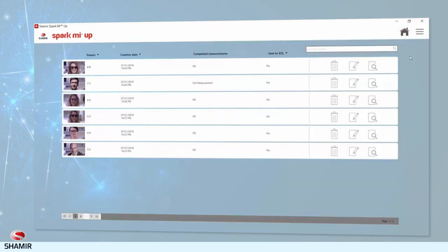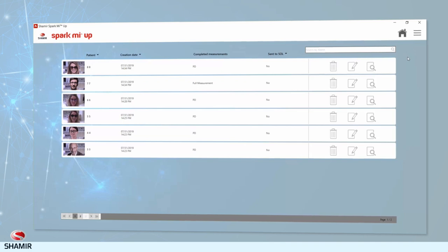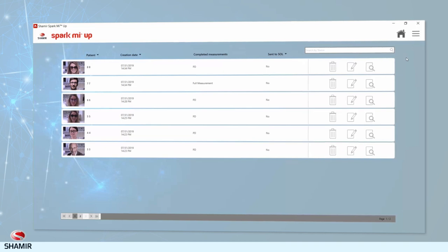The Archive screen allows you to manage your archive of measurements. To review or adjust any stages of the measurement, click the Edit button of each archived measurement. To view the measurement results, click the View button of each measurement at the Register stage, just as you'd view them on completion of a measurement.